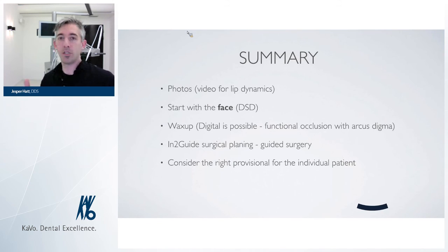How do we want the soft tissue to look in the end? Can we use something that is removable to shape the soft tissue? Do we have to place something on the implant to shape the soft tissue?